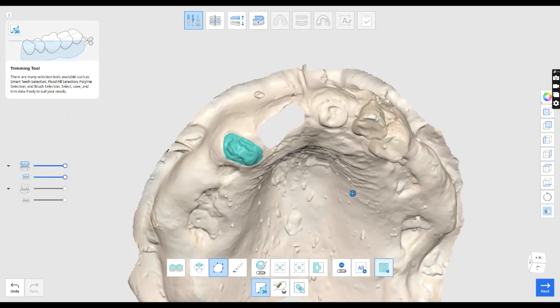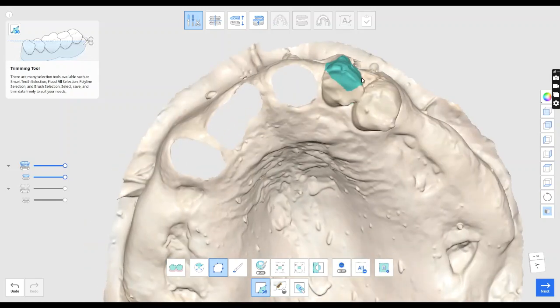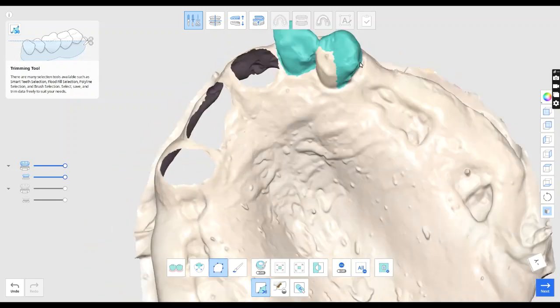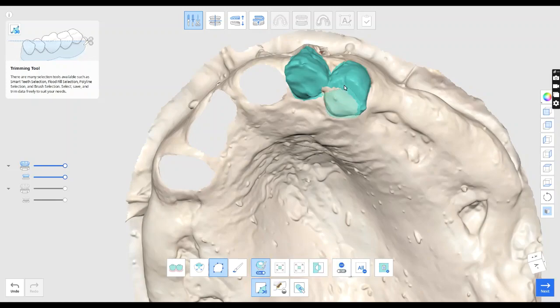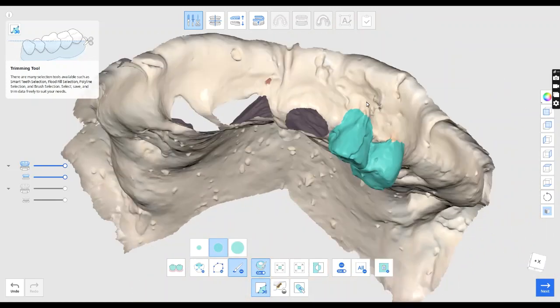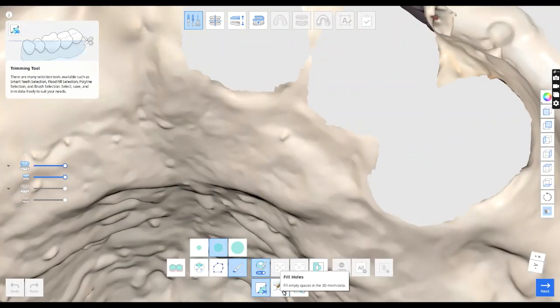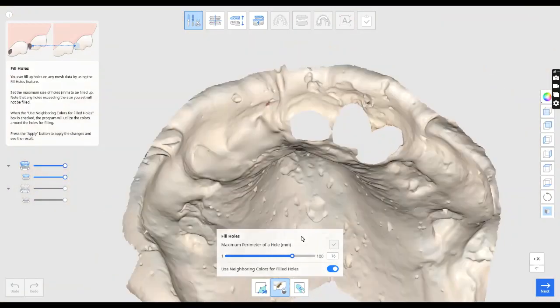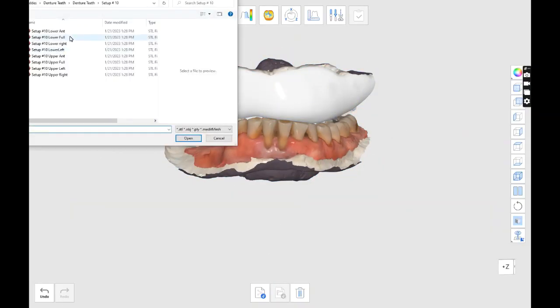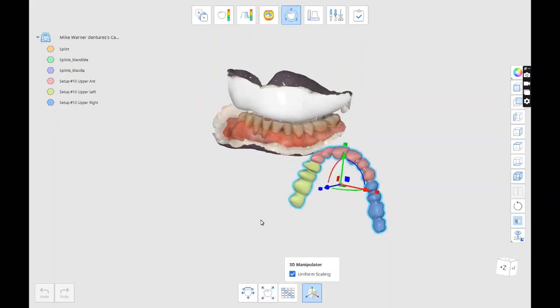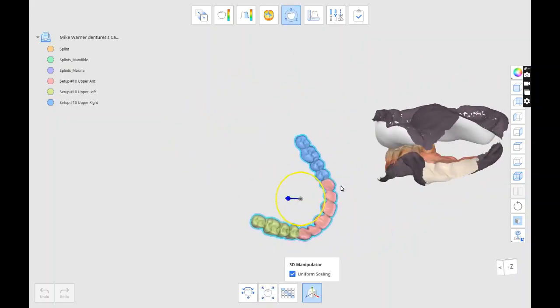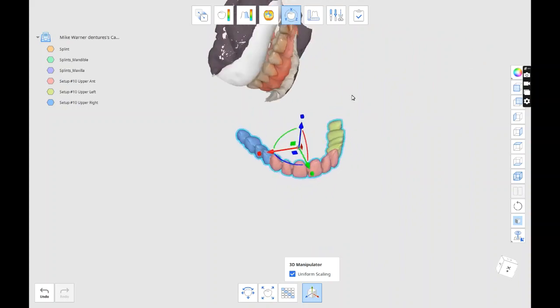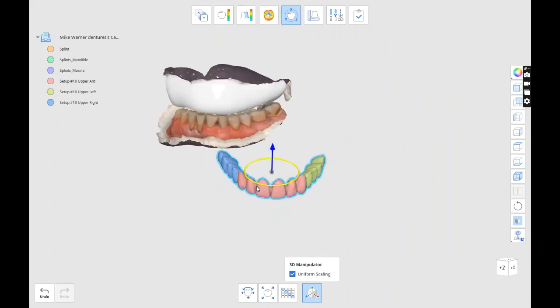I went into Medit Splints and I'm going to just extract the teeth, and we're going to turn this - this is an immediate denture I'm trying to make. I find that if I do it as a splint, it's a lot smoother and it brings the gum tissue up to the teeth, so it's a lot less sculpting in my hands to try to get the gums to match the teeth. So I just went ahead and made a splint.